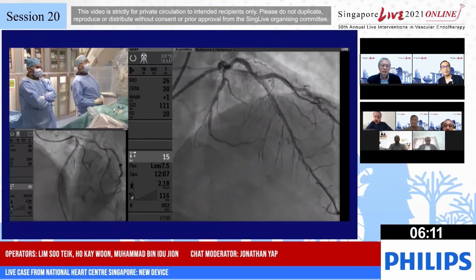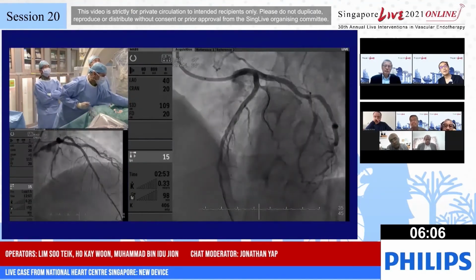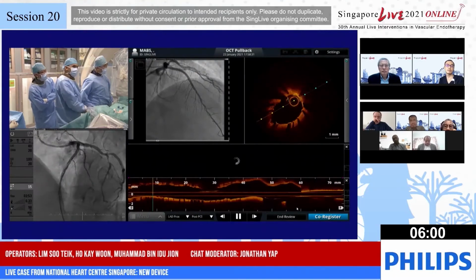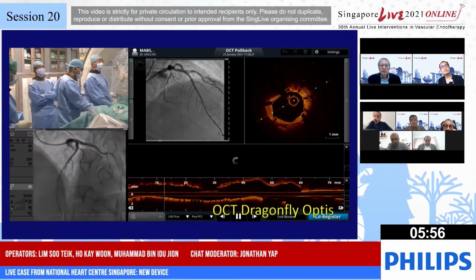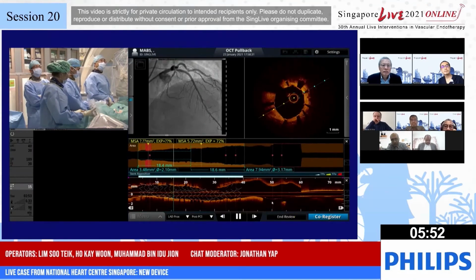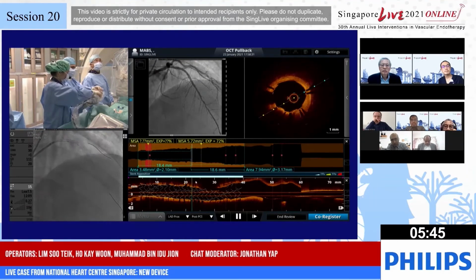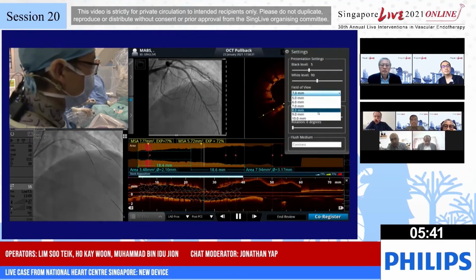Yes, move a little bit. Maybe you can project the OCT image. I'll stand close to Jian so that he can give his expert opinion on the OCT.